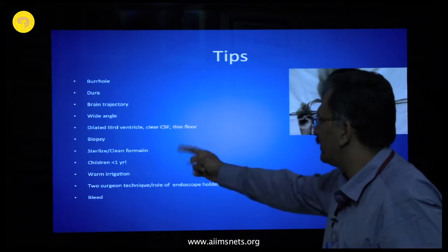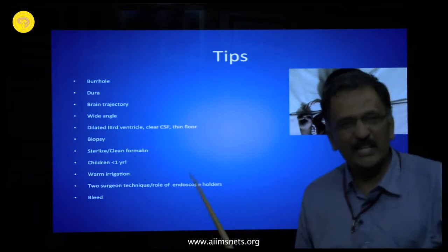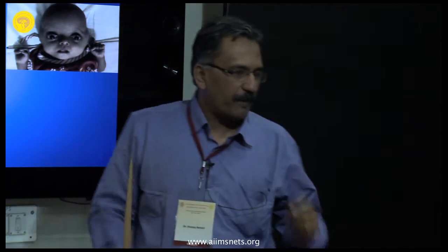Then the third is the technique of taking a biopsy. I've found that there is a very nice technique to doing it. What happens is that you just put it inside and you don't know when to open the scissors or when to open the biopsy forceps. And if you open it within the endoscope tube, you are going to damage your instrument. That's a very simple thing, but it's a very practical problem which I've seen.